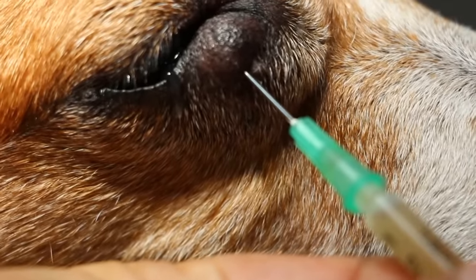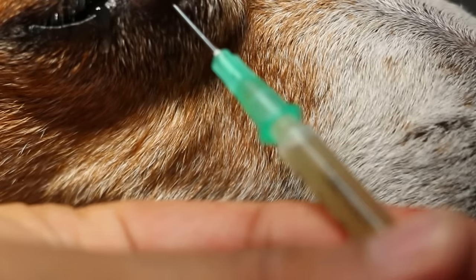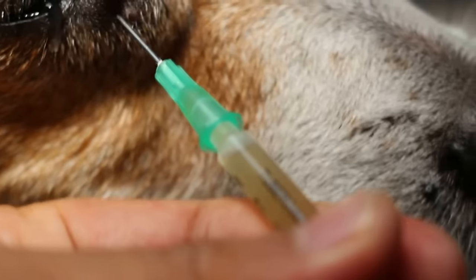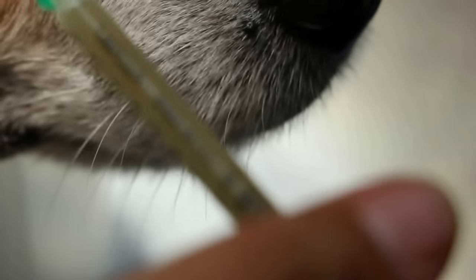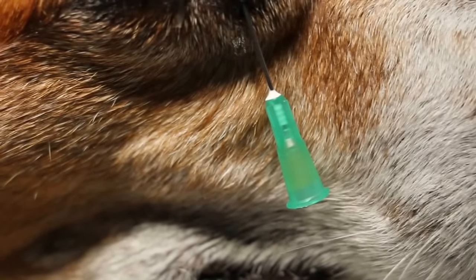If it's a cyst, we suck it out and send to the lab. It could be an abscess as well — sucking it all out first. It could be the encapsulated abscess. At least 1ml, as you can see. We keep this fluid and send it to the lab.